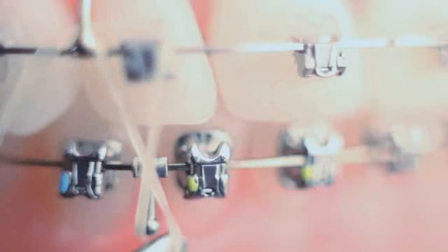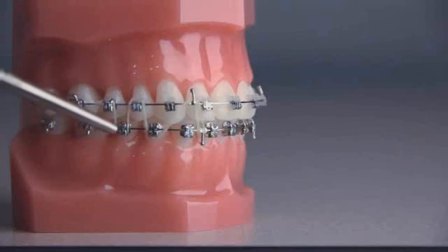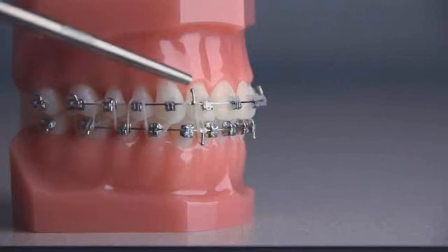You're going to skip the clear hook bracket and go straight to the hook that's attached to the wire, and then end around the bottom hook that's attached to the wire. That may sound a little confusing, but it's pretty simple once you do it a few times. There should be 5 brackets with a rubber band around them and 2 hooks.